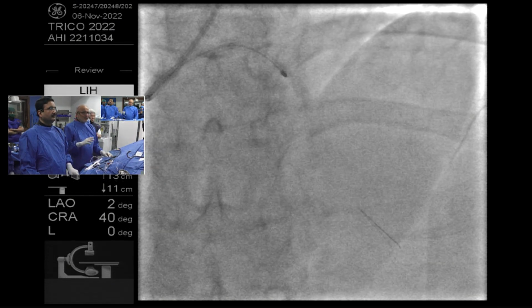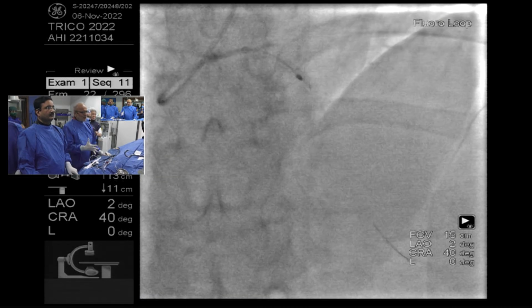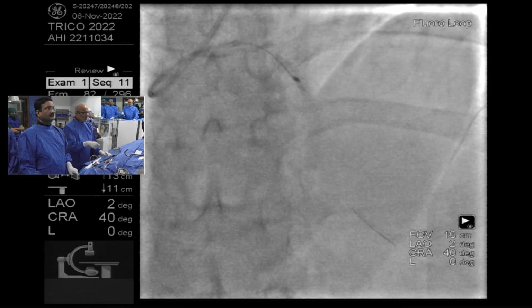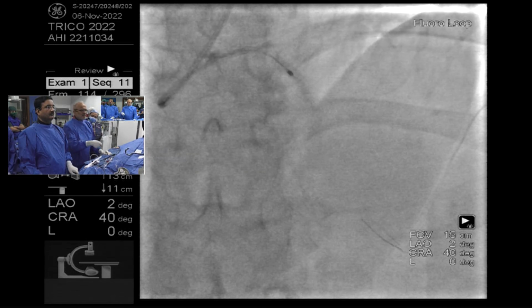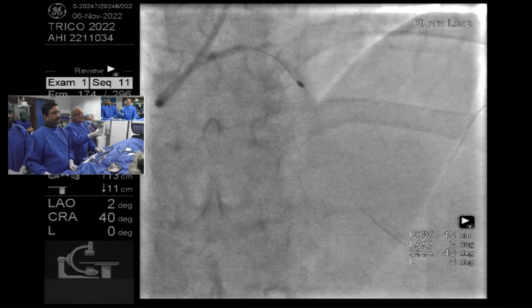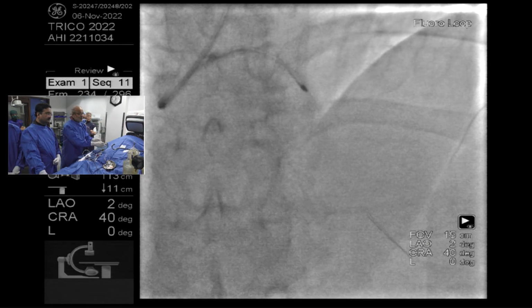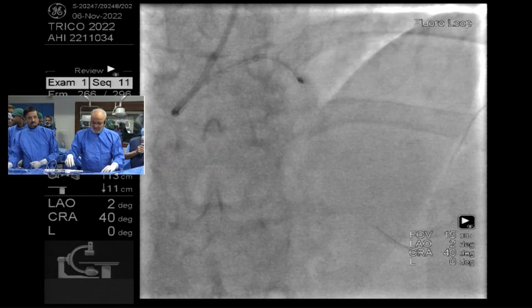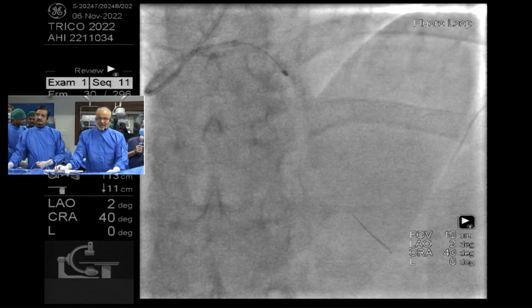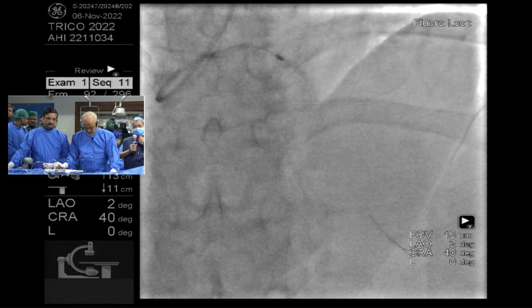The problem sometimes is that any new cardiologist who wants to get involved with all these devices feels that with a lithotripsy balloon we can straight away push and do it. No, this won't work. A lithotripsy balloon simply will not go in. That is true. So, Rota is one procedure which has survived for almost 30 years, right? Although the uptake has not increased, it has survived for a very long time. 1993.